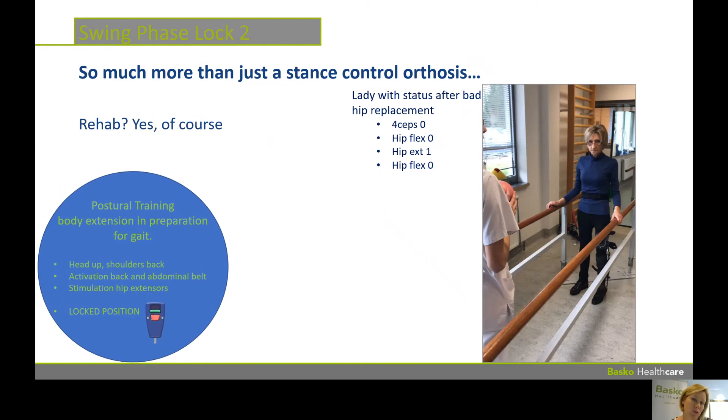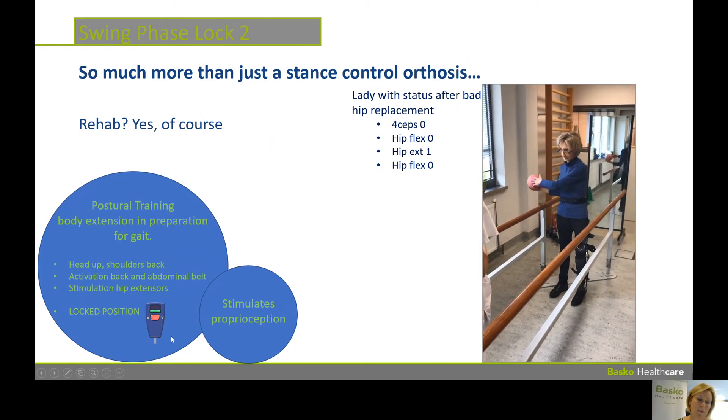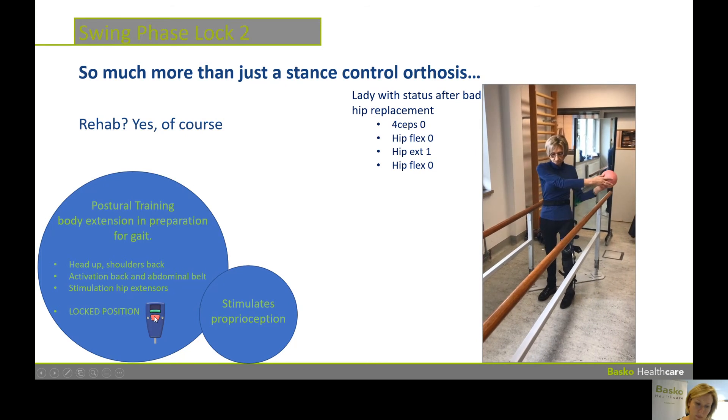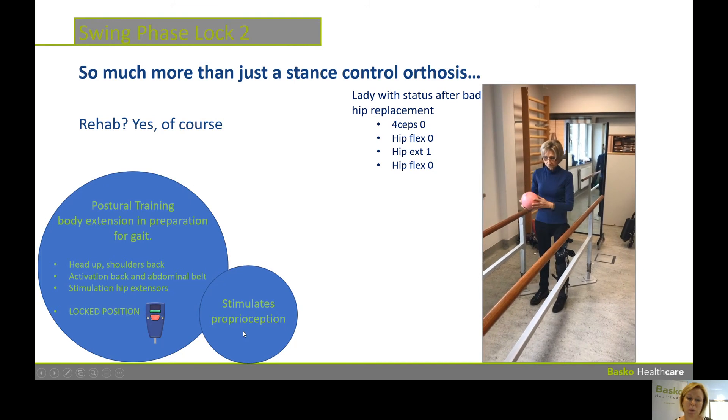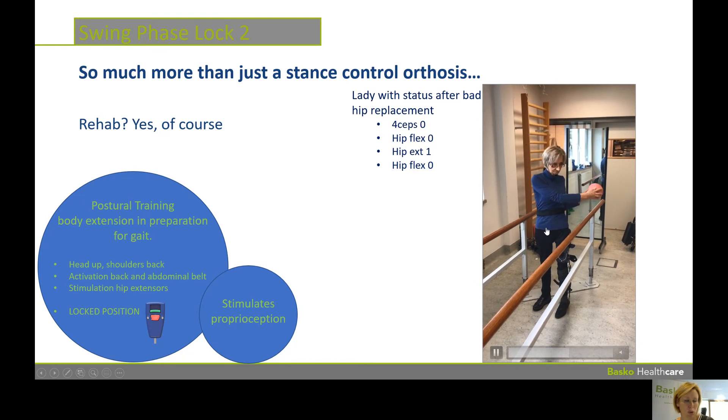What do we do during postural training? We train the body extension to get in preparation for gait. What we ask people is just to stand up, head up, shoulders backwards, activation of back and abdominal belt muscles, and we stimulate the hip extensors. We can do that in the locked position of the device. The SPL will be locked by pushing on the red button. Using the SPL in the locked position will stimulate the proprioception of the upper body. You can see here a lady training and she's able to stand still and to control her upper body.